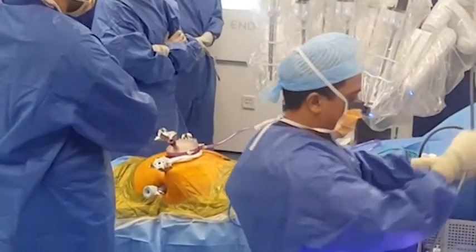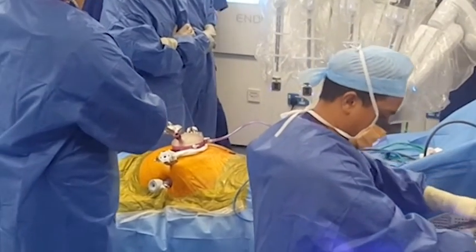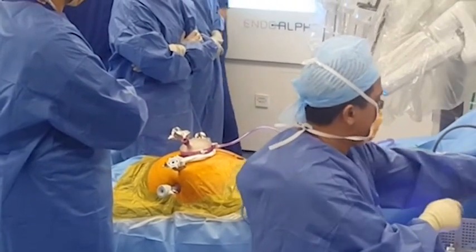So for the patients, the key advantage, especially with kidney transplantation, is the avoidance of a huge scar. What the robot allows is a minimally invasive approach, with just 4 or 5 small wounds and a slightly larger one near the belly button. And this means that they're in and out of hospital quicker, they lose less blood during the surgery, and they have fewer complications after the operation.